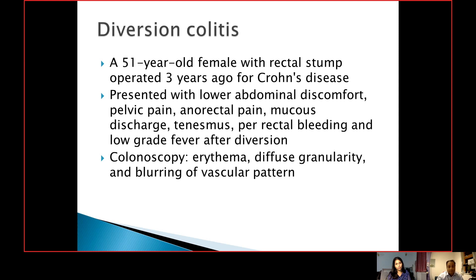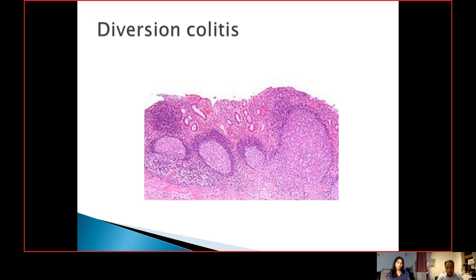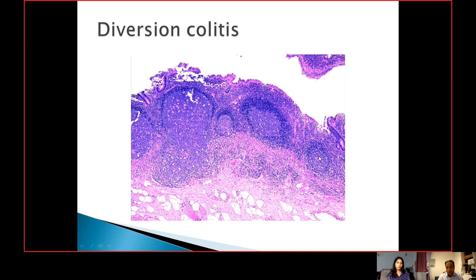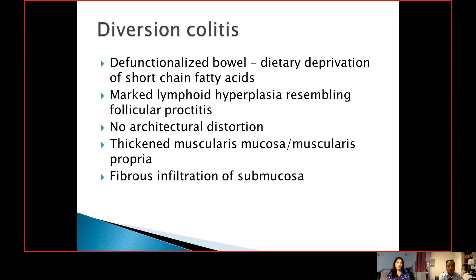On H&E at low power, you can see this crypt which is pretty much unremarkable, but what is most striking is these lymphoid aggregates with prominent germinal center formation, giving the appearances of a follicular proctitis. On higher power, the same finding — you can see marked lymphoid aggregates with prominent lymphoid follicle and germinal center, and very few unremarkable crypts. This is due to defunctionalized bowel with dietary loss of short-chain fatty acids, normally produced by gut bacteria. There is marked lymphoid hyperplasia resembling follicular proctitis, with no architectural distortion.